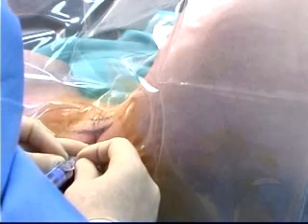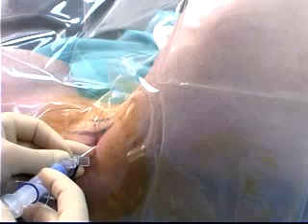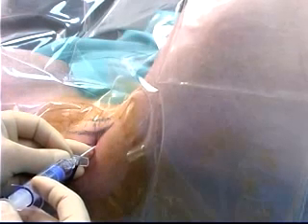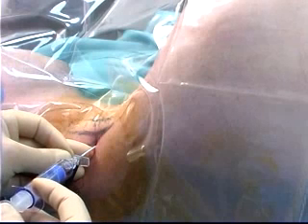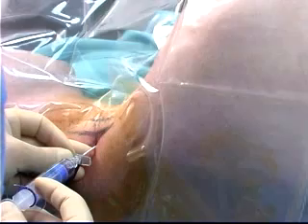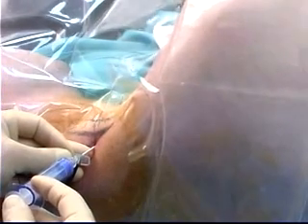This recording gives a posterior view of the loss of resistance to air and motor response appearing simultaneously. Observing the patient's mouth, it can be seen that the patient reports a sensory pulsation before the motor response appeared. This is more common in young subjects.